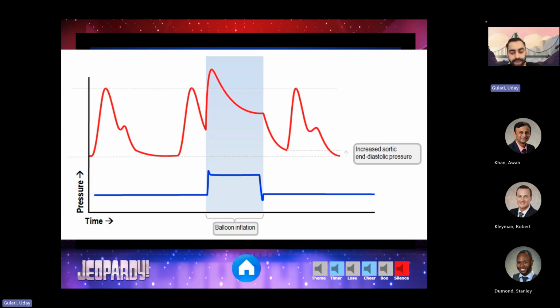The delay can happen because if the catheter is kinked anywhere, the helium flow won't be able to leave as easily, and so the balloon won't empty as rapidly, and you'll get delayed deflation even though the timing is technically all correct.